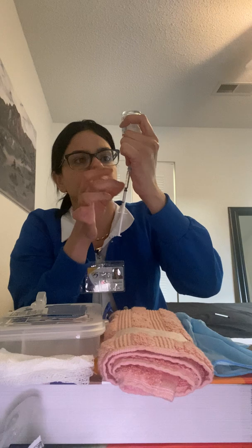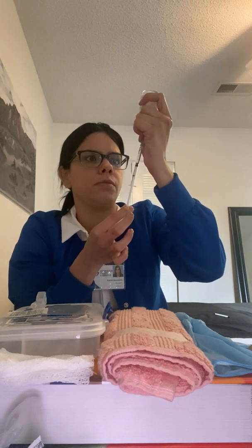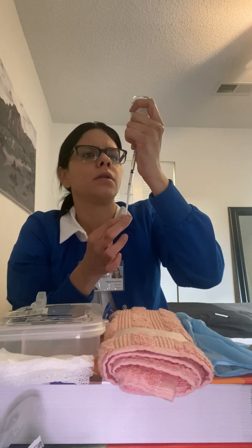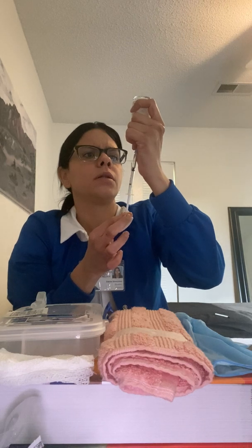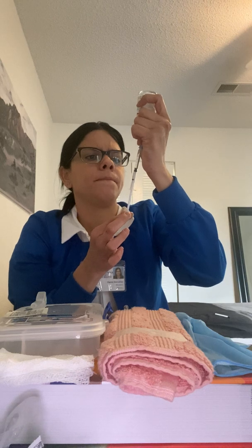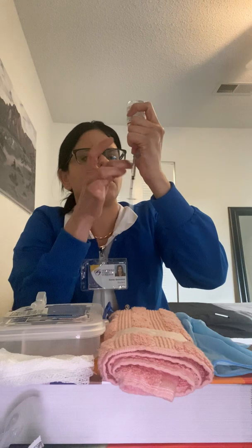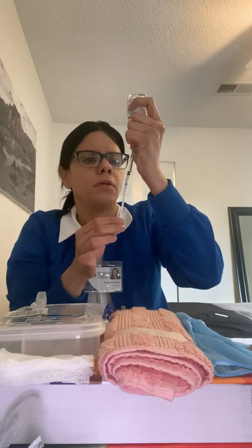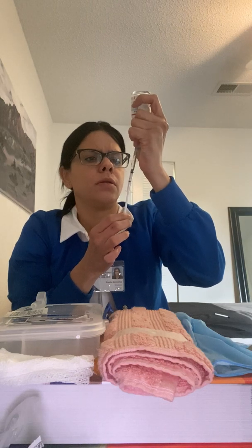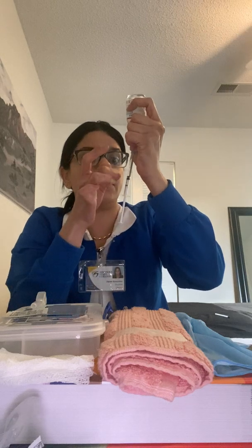I think I have a bubble right here, so I'm going to go back, and getting rid of this bubble.